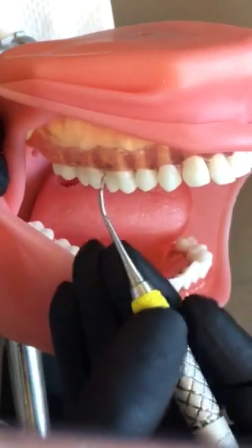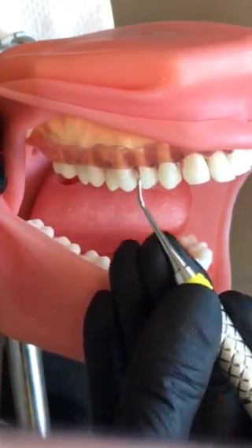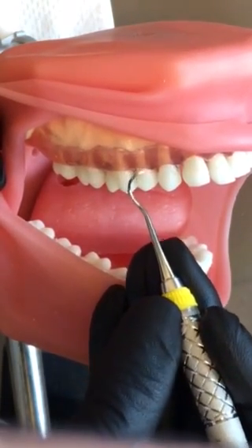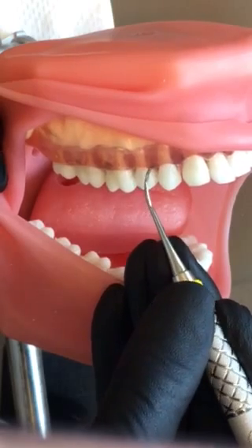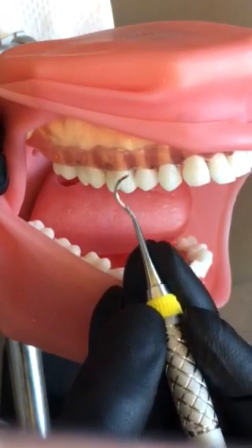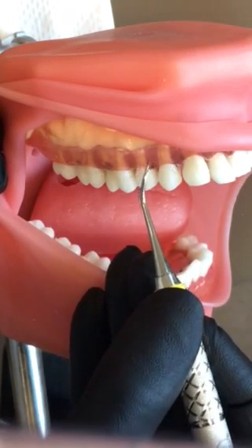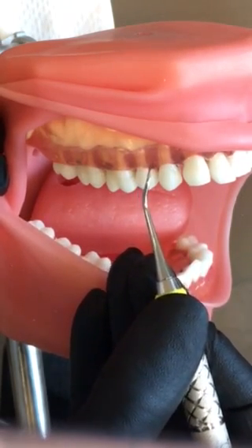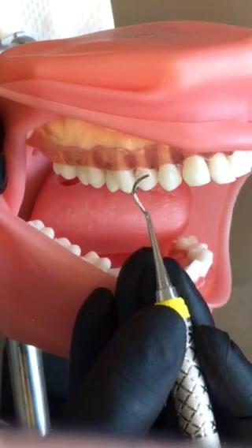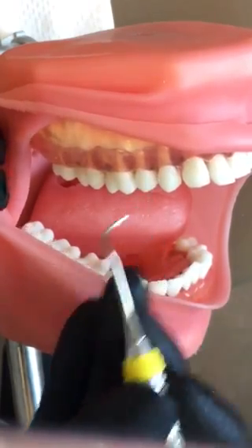You're going to do this all through the posterior. On the premolars, it's going to look the same — distal line angle, roll your instrument. Make sure you keep that tip to the tooth as you round this line angle, keeping tip to the tooth. If I don't roll fast enough to maintain contact with the enamel, then the tip is going to be into the tissue. So it's really important to get that roll down quickly so you don't cause any tissue trauma.